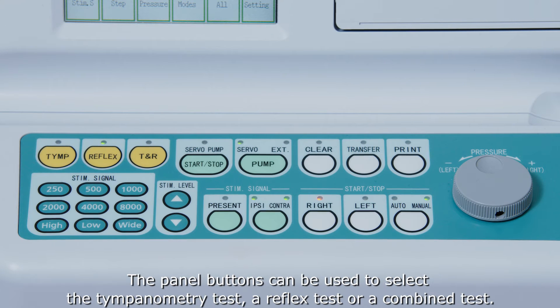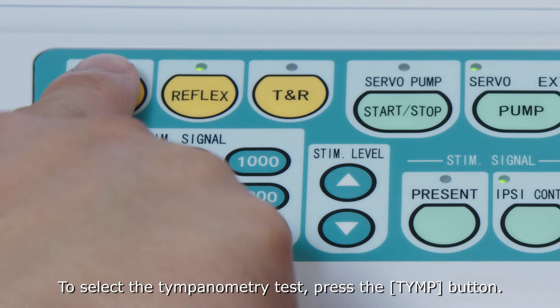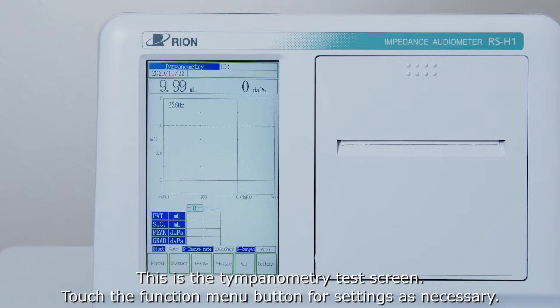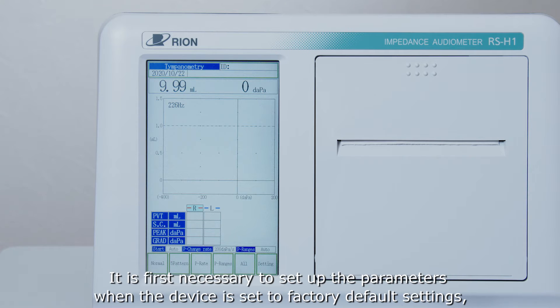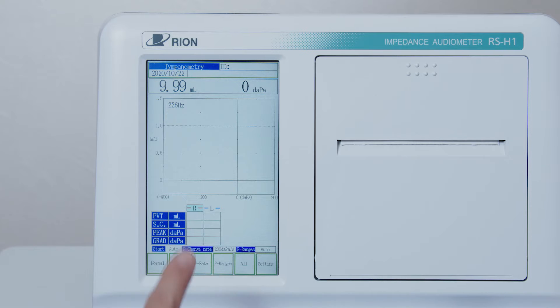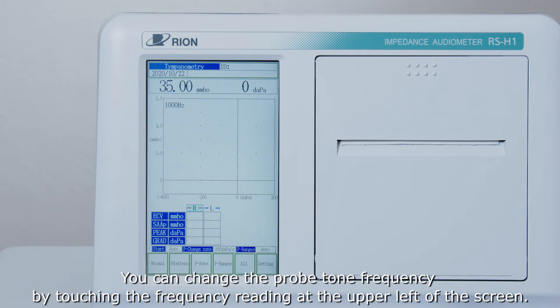The panel buttons can be used to select the tympanometry test, a reflex test, or a combined test. To select the tympanometry test, press the tymp button. This is the tympanometry test screen. Touch the function menu button for settings as necessary. It is first necessary to set up the parameters when the device is set to factory default settings, so please refer to the instruction manual for details. You can change the probe tone frequency by touching the frequency reading at the upper left of the screen.